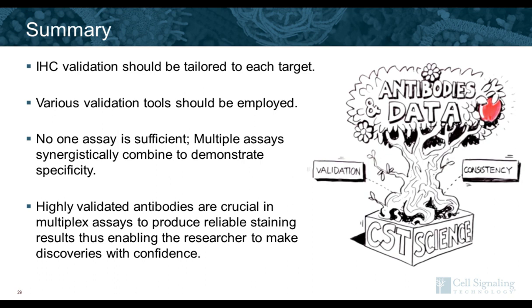Thank you, Bill. Our next question, we have so many questions coming in, looking for some duplicates here. Here we go. Will all antibodies approved for use in IHC work with the Akoya OPAL reagents? Christy, the simple answer to that one is yes. If an antibody is well validated in IHC using singleplex chromogenic staining, then there is a very, very high likelihood that it will work well with the OPAL immunofluorescent reagents.